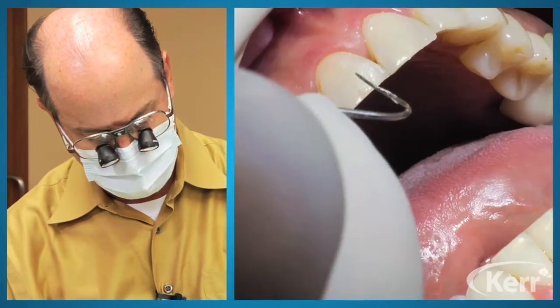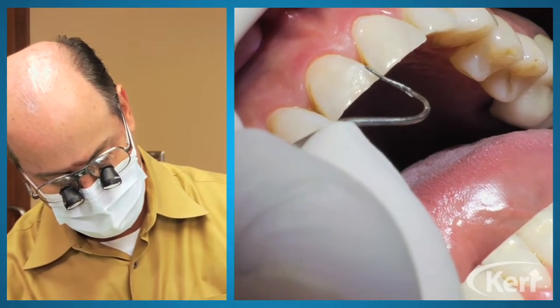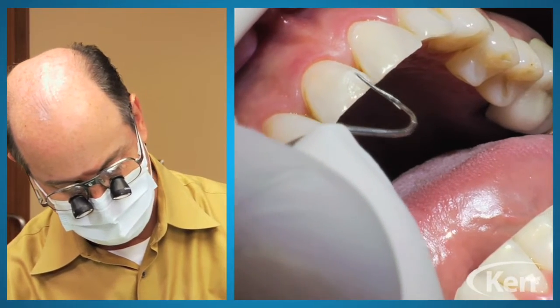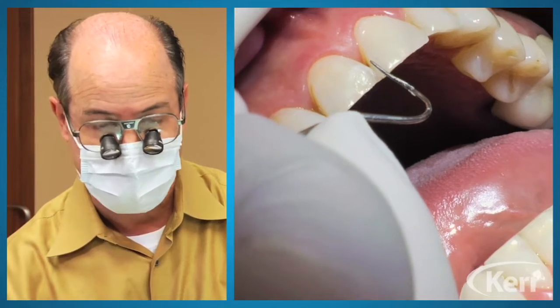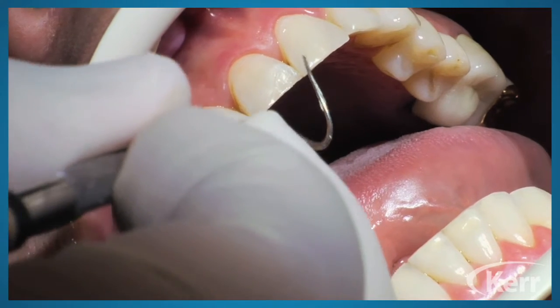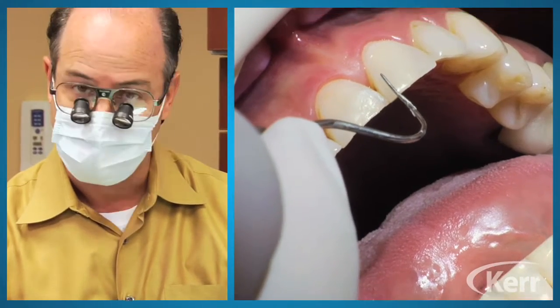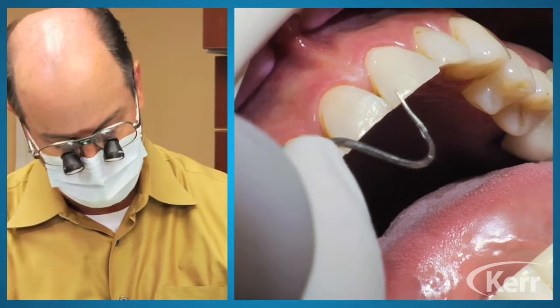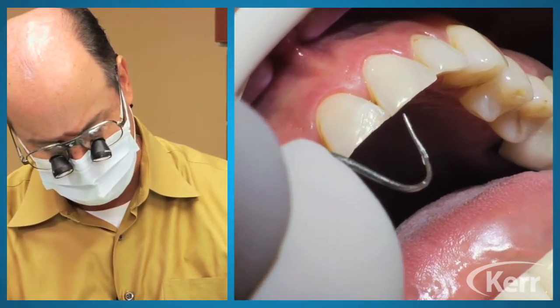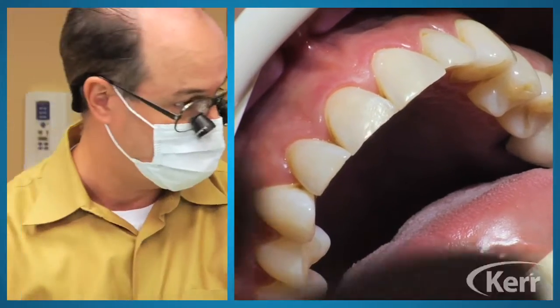Okay, so I've put your classic 45-degree bevel on here, and you're all familiar with that. And then I do what I call a starburst bevel, or some people have called it a scalloped bevel, but I like to put a little starburst bevel to try to break up the light. And then in this procedure, we'll be basically putting down one shade of composite, and probably just because she has such translucency in this mesial corner on tooth number 9, obviously the tooth that we're trying to mirror, I'll probably have to put just a little bit of a second shade there in particular for this case because of her translucency. So but let's see how simple and easy really this goes.